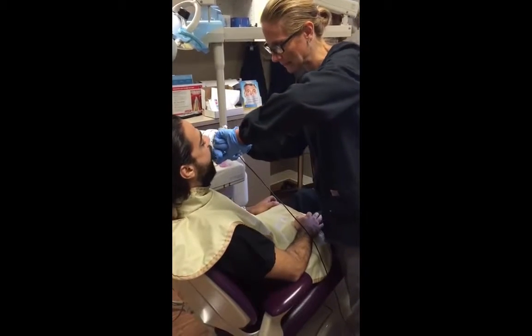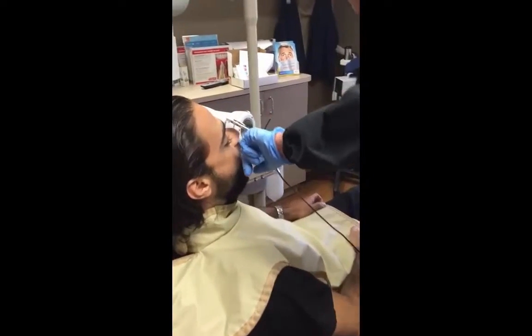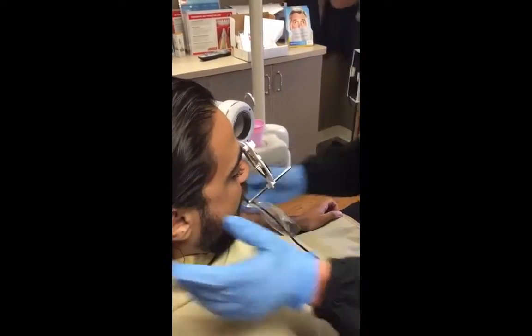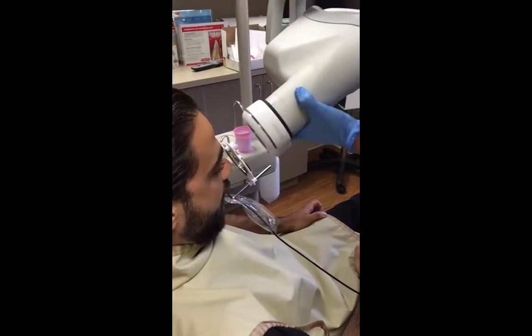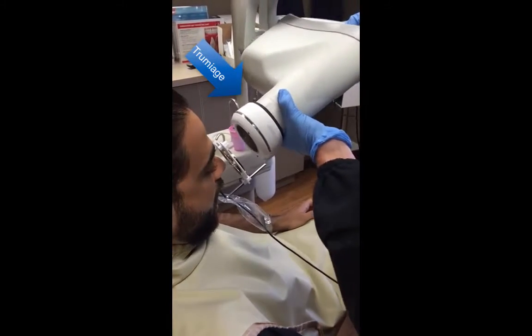Liz is going to place the device in the patient's mouth as if she was taking a regular x-ray. It works much like a normal RIN parallel device, except we're using the True Image device rather than the RIN device.